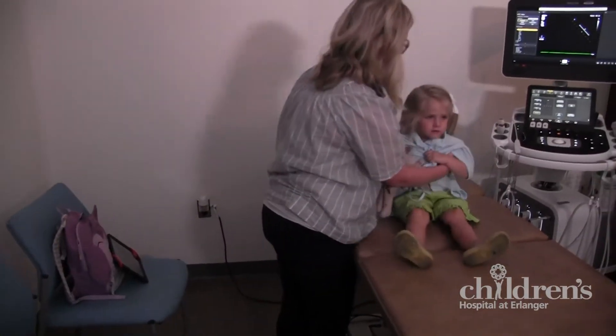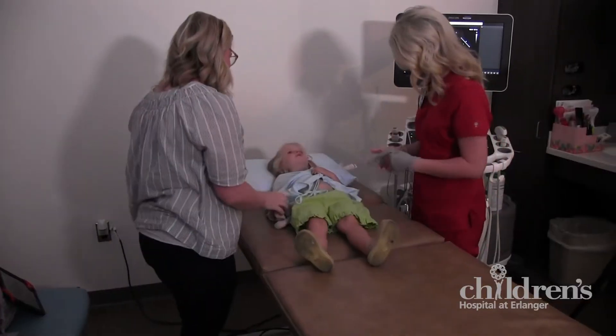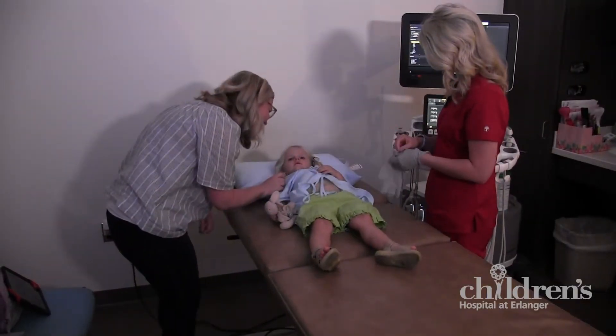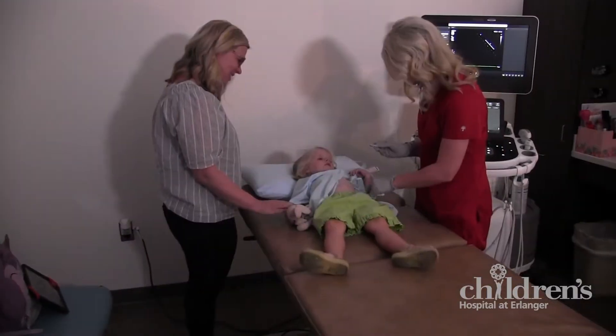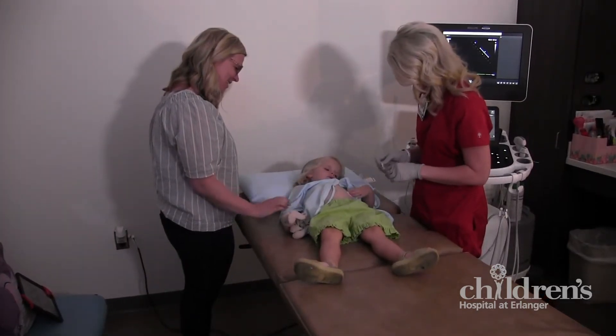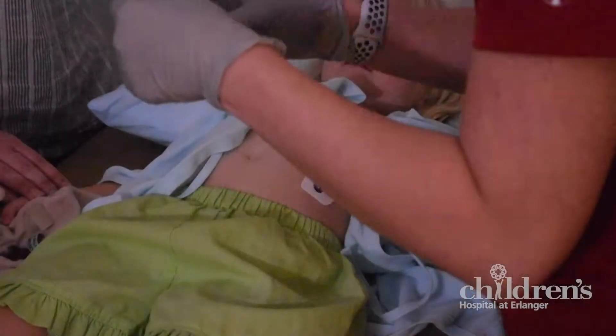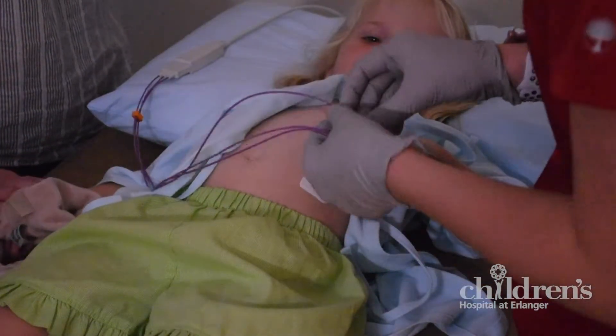First, you will lie down comfortably on a bed or examination table. You will need to stay super still so the test will work well. The sonographer starts by putting three stickers called electrodes on you. These don't hurt and measure the electrical activity of your heart during the exam.